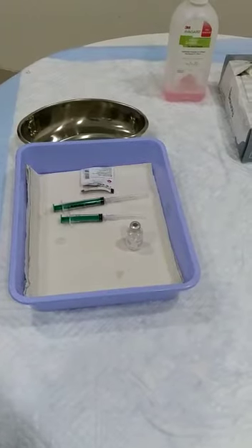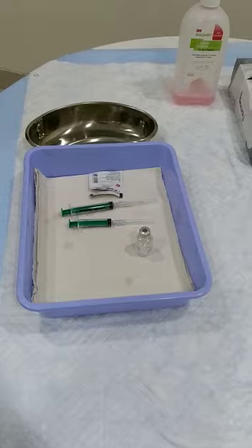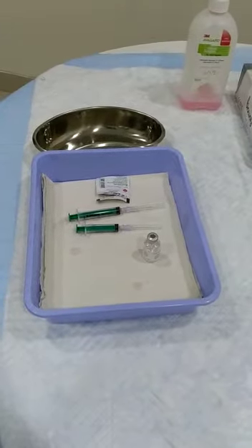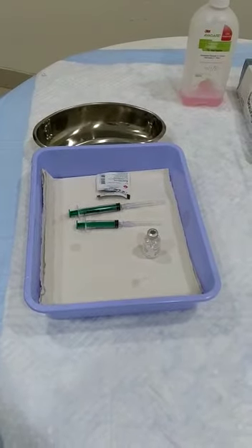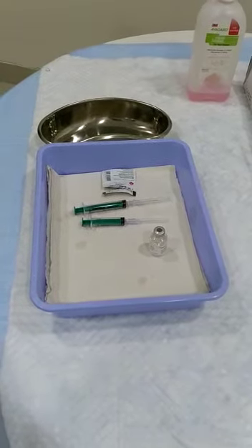Hi all, here we will learn how to heparinize the syringe for an ABG sampling. Articles required are a tray containing a heparin vial, alcohol swab, 2 cc syringe, and an extra needle. Now let's get started.